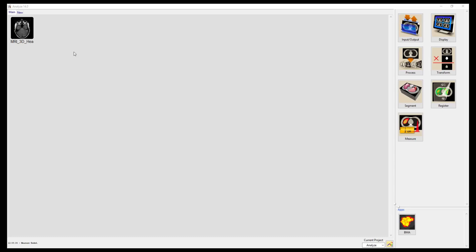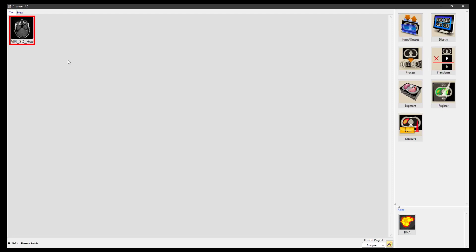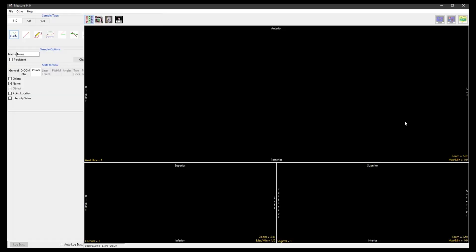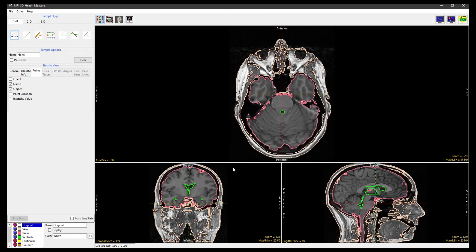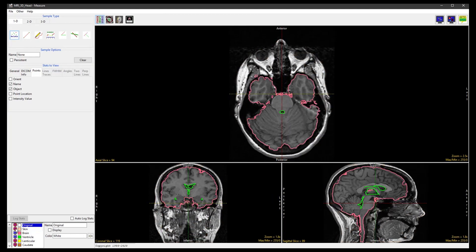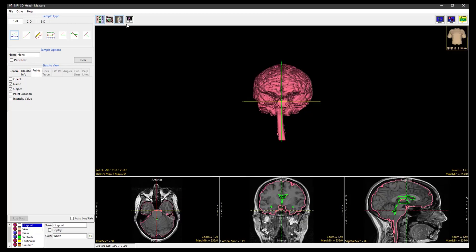To start, select the dataset and open Measure. A previously defined object map is already loaded for this dataset. Here we will turn off the skin object and switch on the render window.